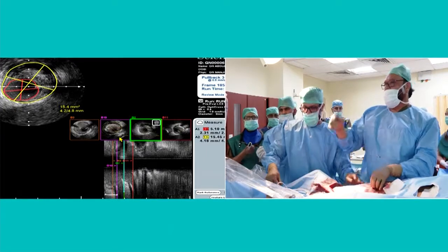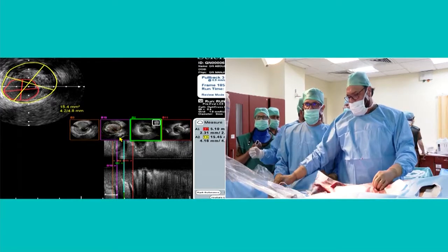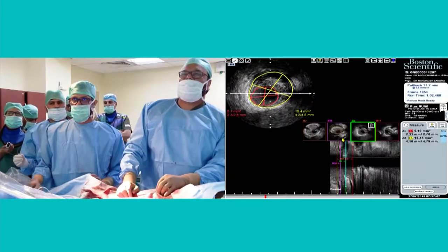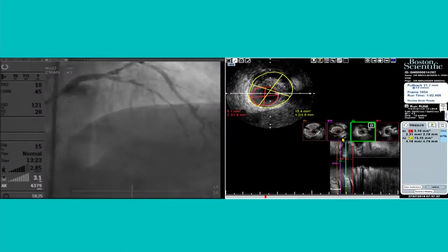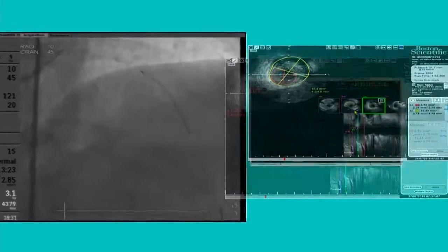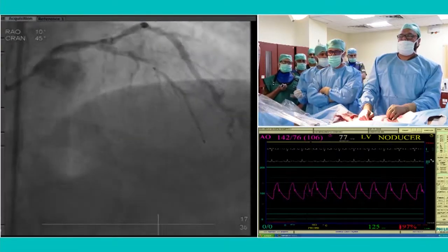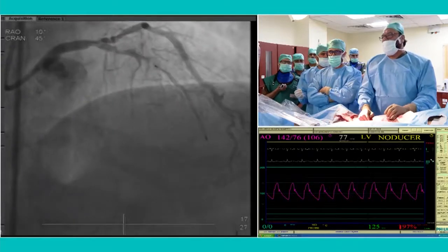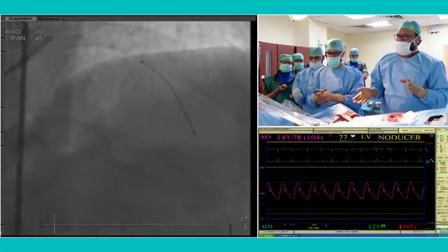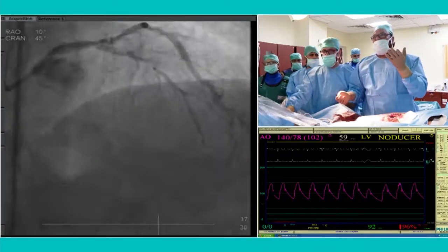Show the stent, please. Dr. Sandhu, actually the vessel looks like you have to prepare the lesion well, especially in the proximal LAD. In this case, a rotablator is not required, but we require a cutting balloon to prepare the vessel. I personally feel that a cutting balloon will not cause that much dissection as the normal NC balloon. That is my perception. Whatever is your convenience and your thinking, you can do it. I would like to use a cutting balloon if my normal balloon is not giving a good result. Okay. After pre-dilatation, it was very good.